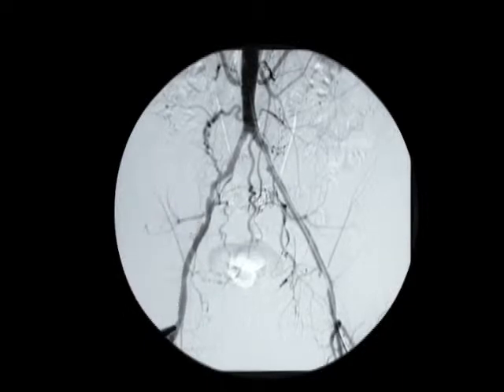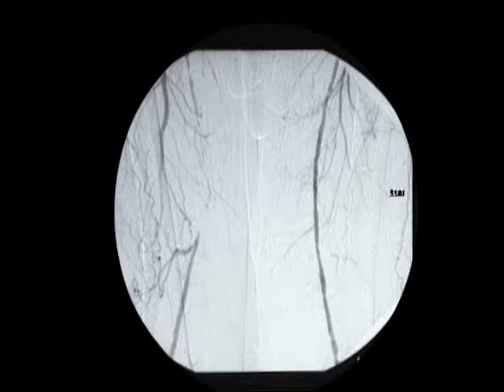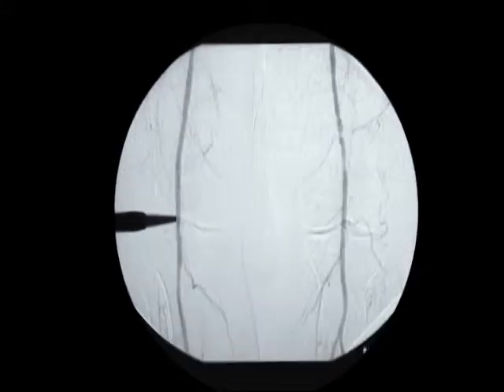The external iliac artery is normal. The common iliac and proximal superficial femoral arteries were patent, but the distal superficial femoral artery above Hunter's canal occludes. We see reconstitution of the popliteal artery in Hunter's canal by very large profunda collaterals. The popliteal artery behind the knee remains patent. A nice collateral is seen medially here, and we extend distally to a tibioperoneal trunk, which is of good quality.